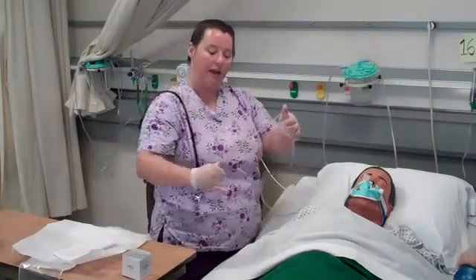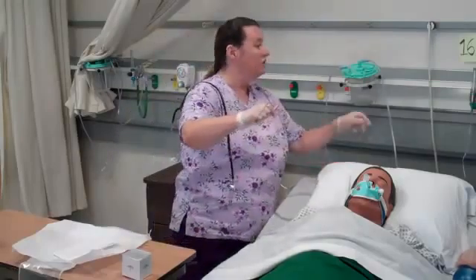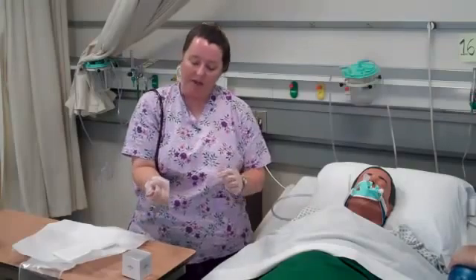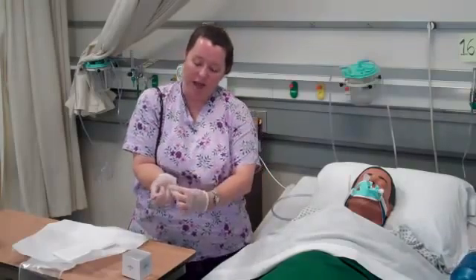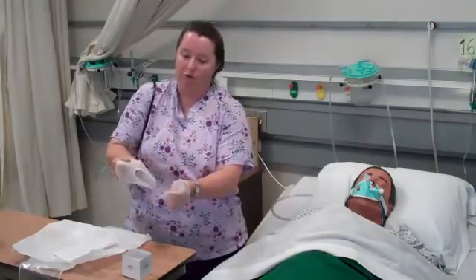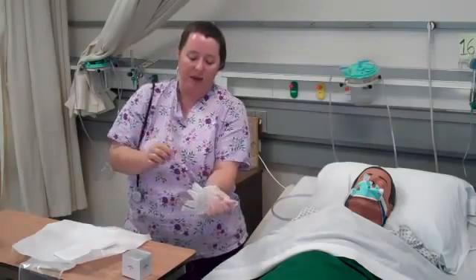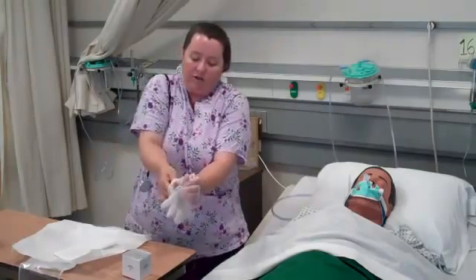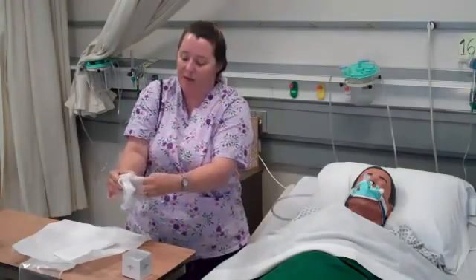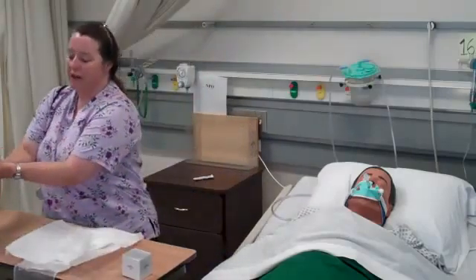I gather the catheter in my hand, remove the vacuum source, and turn it off. Now I remove my gloves: the tubing is in my dominant hand, and I touch dirty to dirty so I'm not touching my skin. I remove the catheter inside my glove, then reach under and pull the gloves over so I'm not contacting any secretions. I dispose of the equipment and wash my hands.